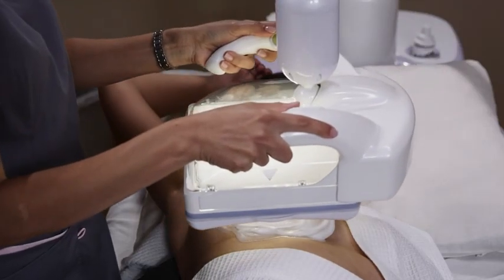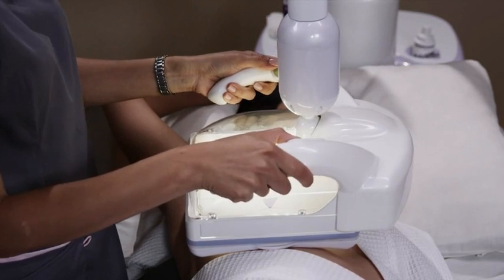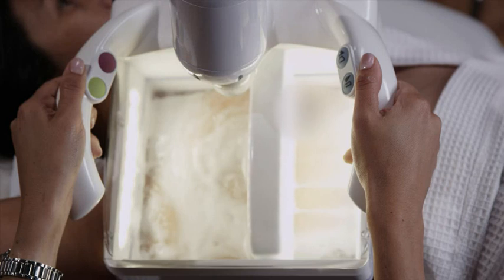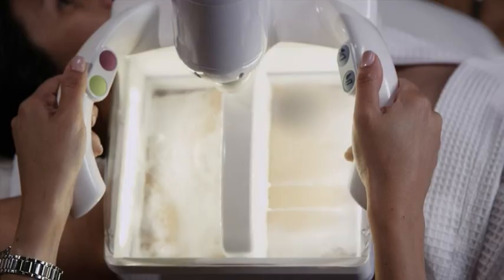The operator will place the scanner on your breast and apply gentle compression to help ensure that there is contact with your skin on all sides. Once the scanner is in place, the operator will start the scan. It will take about 40 seconds to move across your breast.